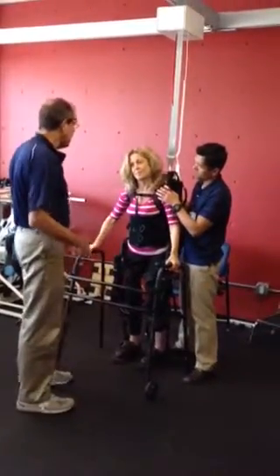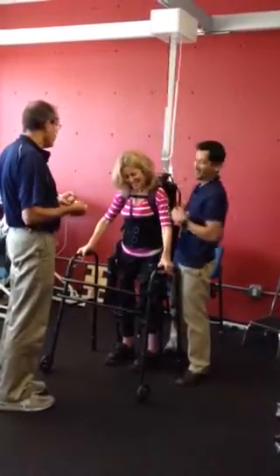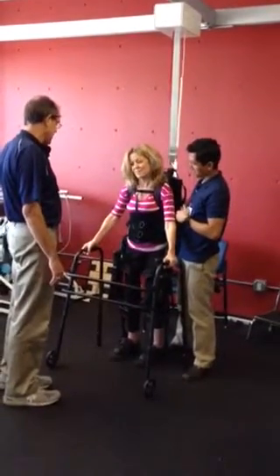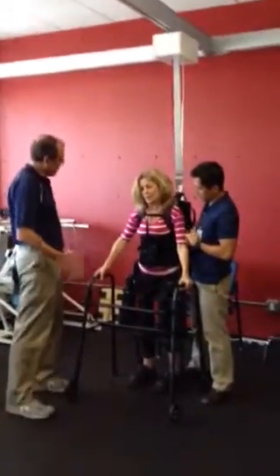It can — this one can. It's a variable one. So we're both falling? Nobody's ever falling. You're going to be fine. It's just unsure of the whole system. And you haven't been walking, so it's just scary.